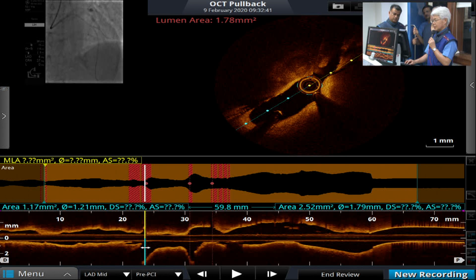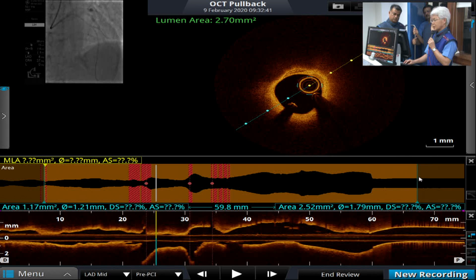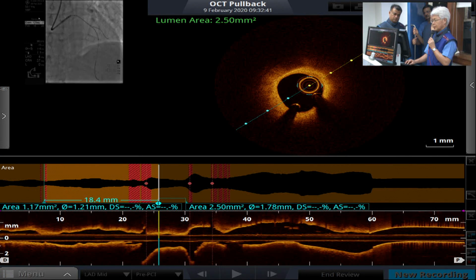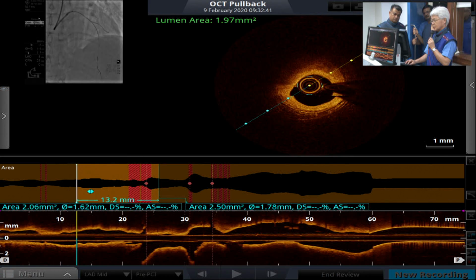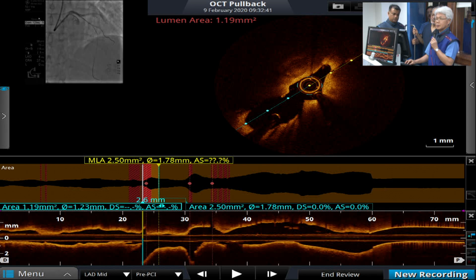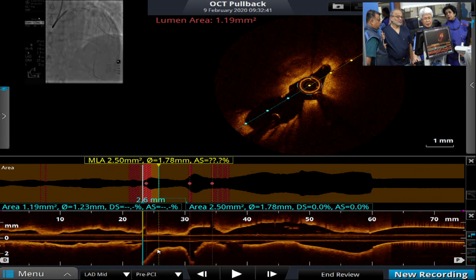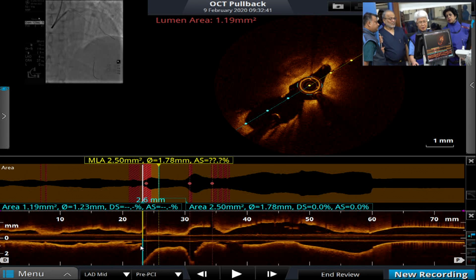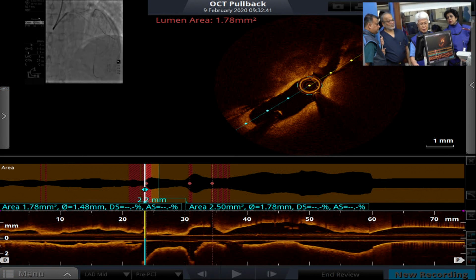Quite easy, right? And then, as I told you, I try to check the length from the tip. Here is 2.6 millimeter, right? And also you can try to measure this tip angle. More than 50 degree is very important. How to measure?